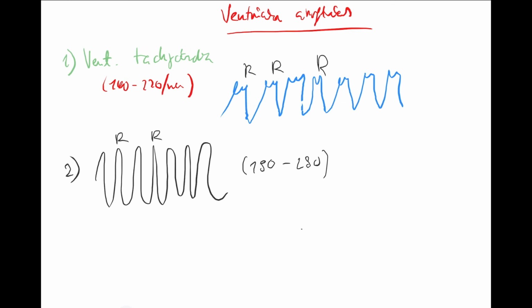And remember, in case of, let's say, V-tach especially, and debatable, I will put it in brackets, V-flutter, you are still using cardioversion. What does it mean? You put the machine with which you shock, but the machine reads the ECG. And remember, you never want to send a shock when there is a T, because you could cause an even more severe arrhythmia in repolarization. So basically the machine reads the ECG and it is still able to read it over here and over here. So it waits, it reads the ECG. When you push the button, it still waits. It shocks the patient during R typically. Okay, so you call this cardioversion.